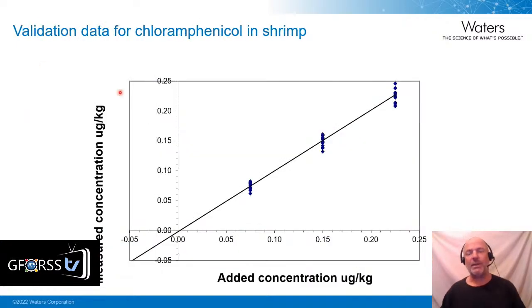When we're looking at CC alpha for banned substances, we just need to create one regression line. So we basically plot the concentrations from the added concentration, the spike concentration, if you like, against the measured concentration over the 3 levels, and then we create this regression line.